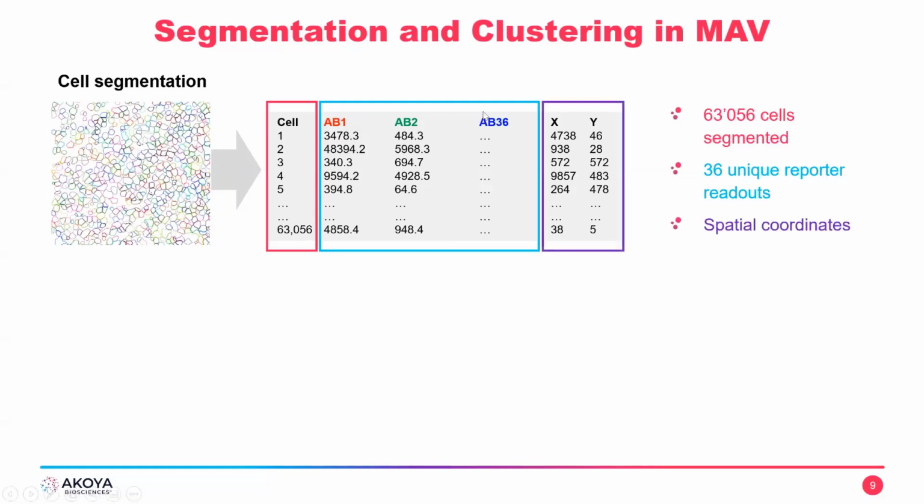Now, in contrast to some other single cell techniques or some other multiplexing techniques that people use, like single cell genomic sequencing, we have spatial coordinates. This is key. This is an in situ result. We know exactly where every cell is. So how do we analyze these data?